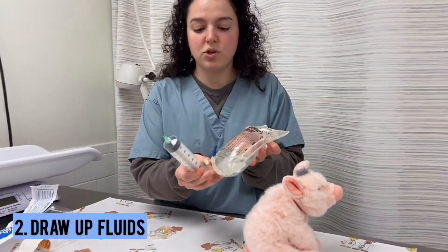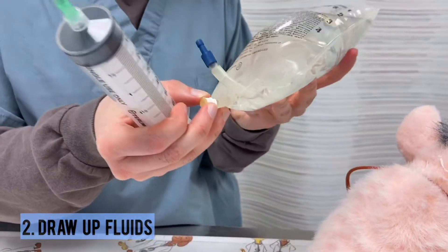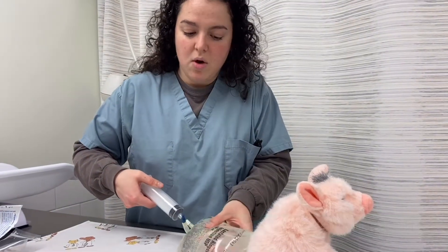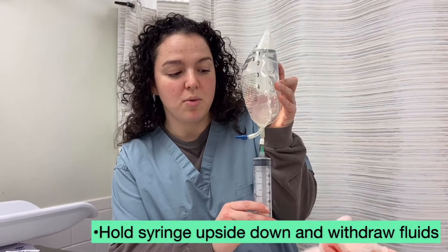As you can see on the fluid bag, we have two ports here. We'll be using this port to inject the needle and obtain our fluids. Hold the bag upside down to prevent any air from getting into the syringe, and gently pull back.